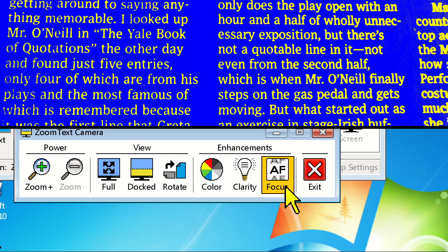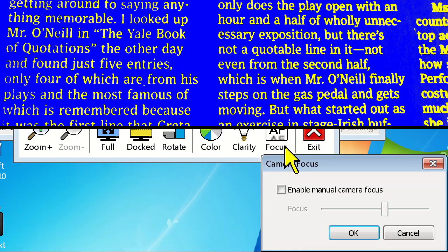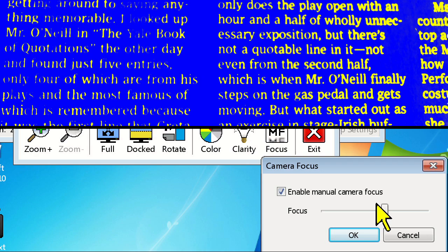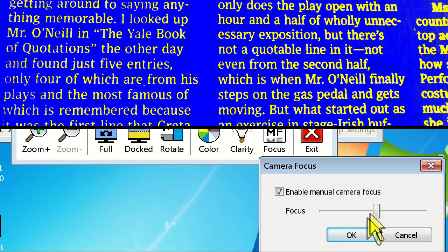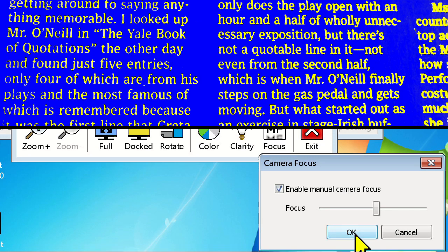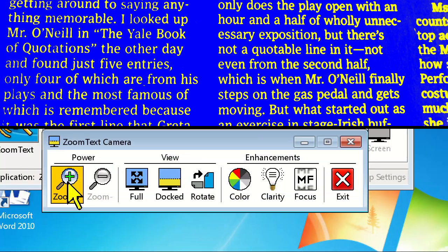Sometimes these cameras may not autofocus immediately or struggle to focus on certain material. If we click on the focus icon and check Enable Manual Camera Focus, you can drag the slide bar to manually adjust the focus. Click OK to lock in the focus once you have it set. As long as the length between the camera and your object isn't changing, you won't have to change this setting multiple times.